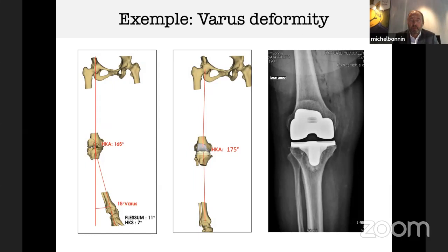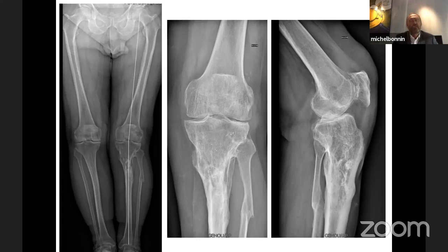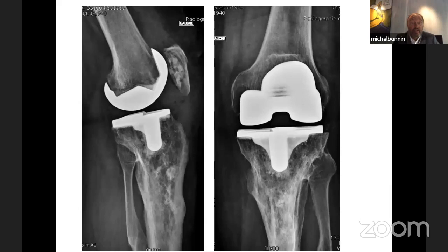This is a patient who has been multi-operated due to a tibial fracture, who had an infection of the tibia at first, and I did a custom knee prosthesis. It was quite easy because I no longer need to violate the canal. I don't need to put in guides. I just follow the custom guides and put in a custom implant.